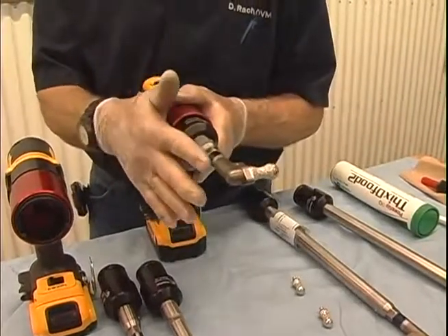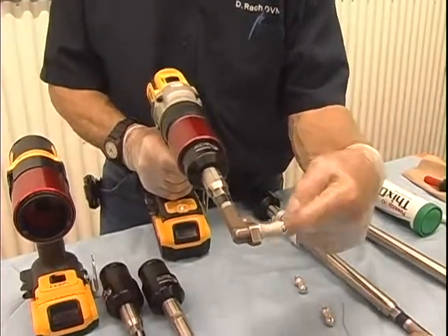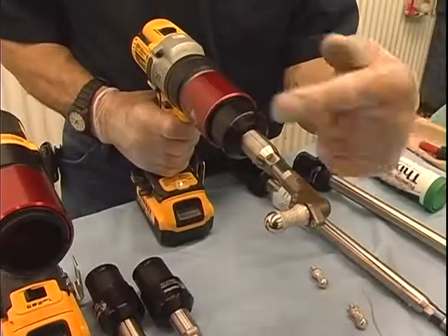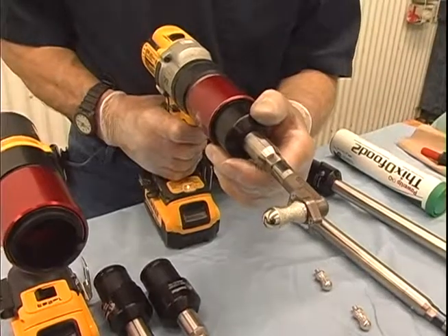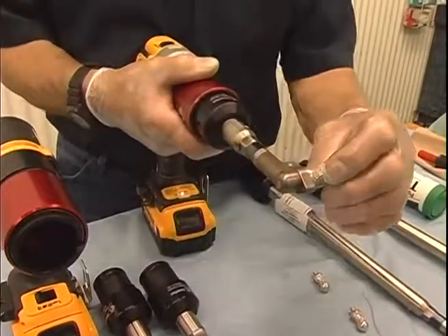Again, I would keep the right angle in this position so that the wheel is rotating towards the teeth. If you were going to float in this position, the wheel would be rotating away from the tooth and would tend to migrate down to the gum, and it would not be a very safe way to be floating teeth. So it should always be in this position.